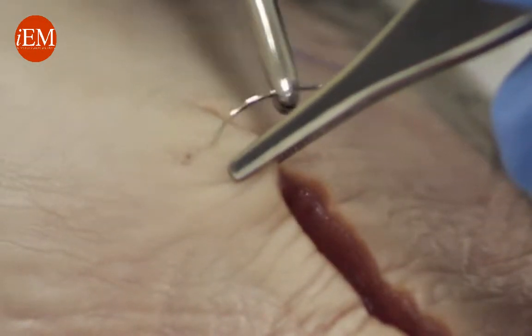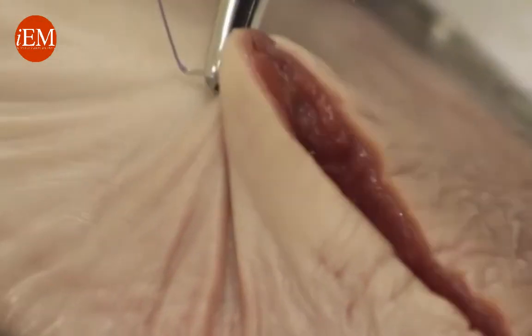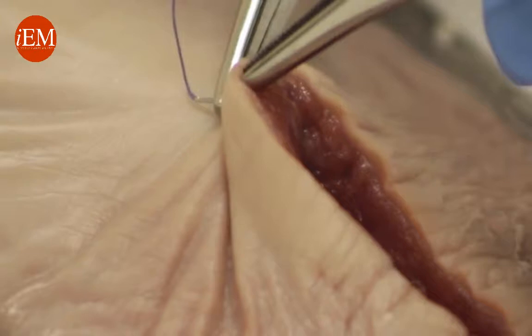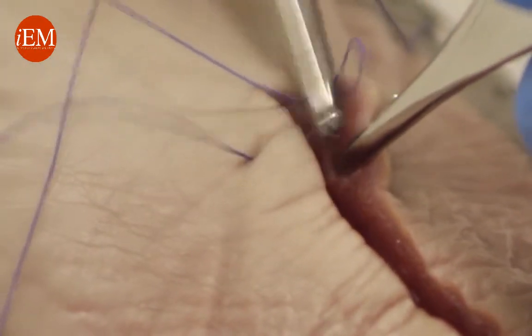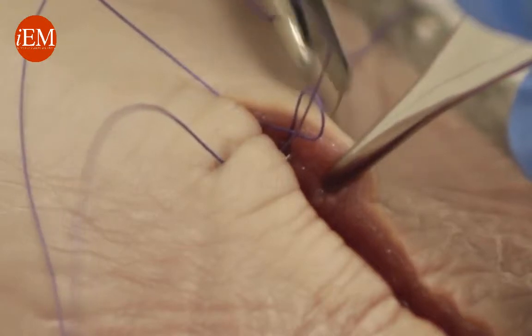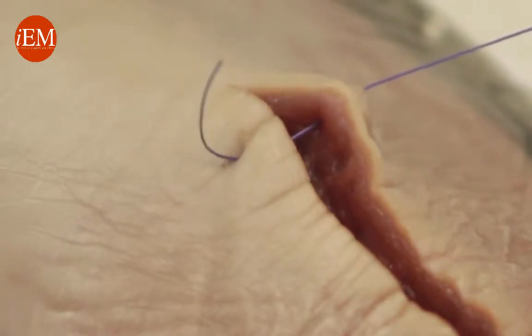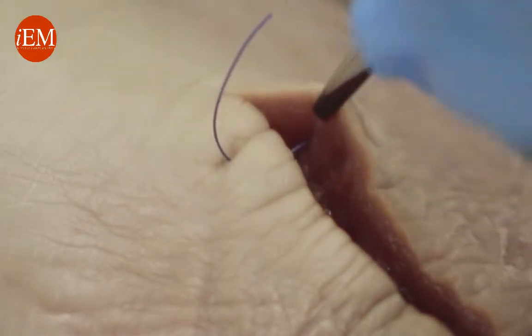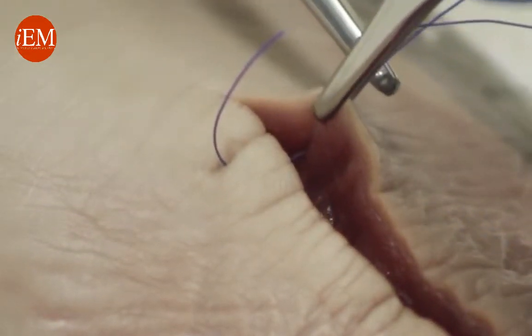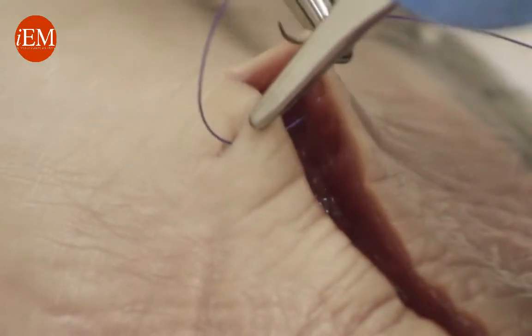We go perpendicular, come through the middle — don't grab the tip — come around the other side. Turn your needle around and grab the edge of the skin very superficial. Same thing on the other side.